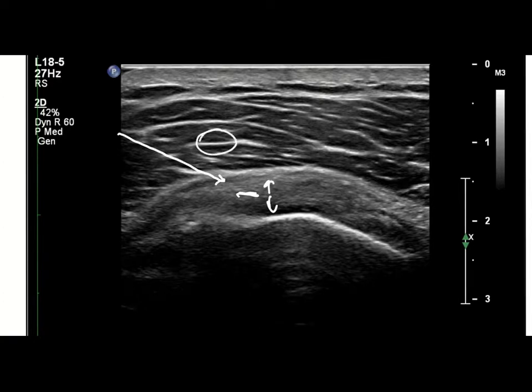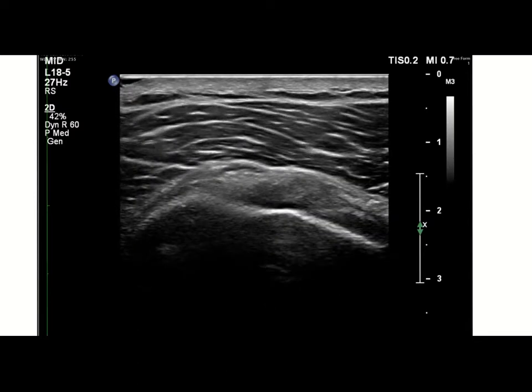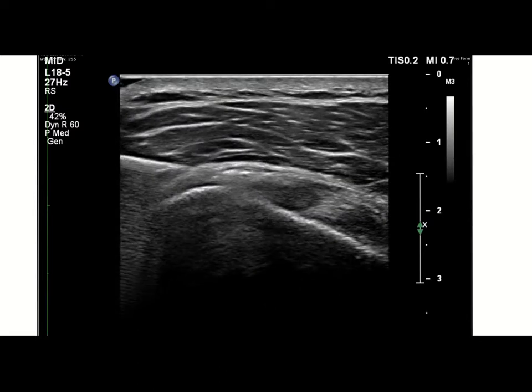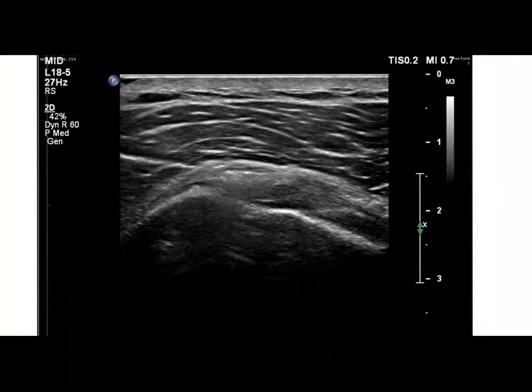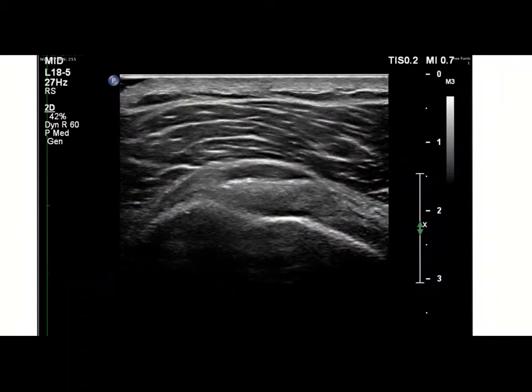You also don't really want to be in the muscle itself, although if you're using steroids you'll get a local effect regardless. What we're going to do is put a needle in, going from left to right across the screen, and infiltrate the subdeltoid bursa space. The tip is now placed into the subdeltoid subacromial bursa — I'm injecting 40 milligrams of Depomedrol and about two milliliters of Marcaine and Xylocaine.